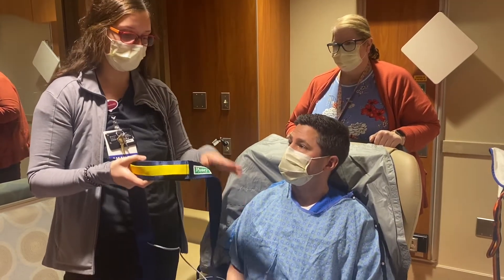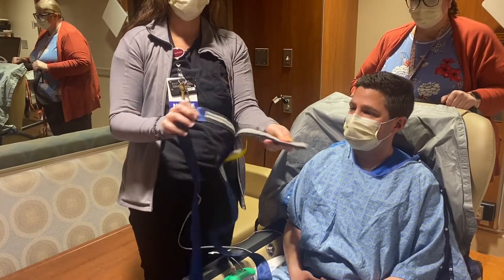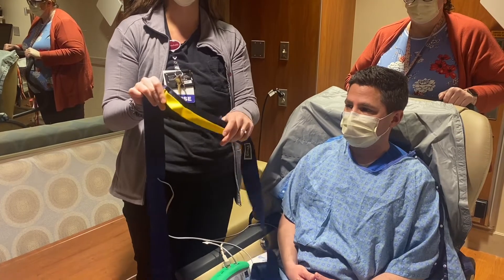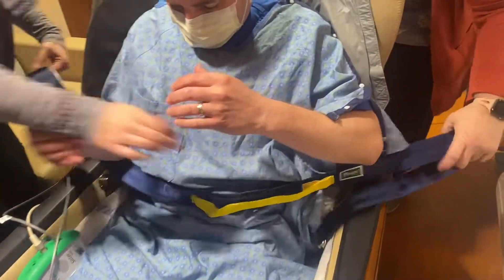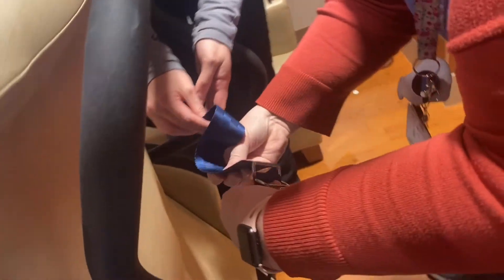Another option instead of using the chair pad alarm is the Posey Velcro belt. You do not need an order for that. This is another way to help prevent falls. You just wrap it around the patient under their arms, like a normal belt, around the chair in the back and make sure it's secured.